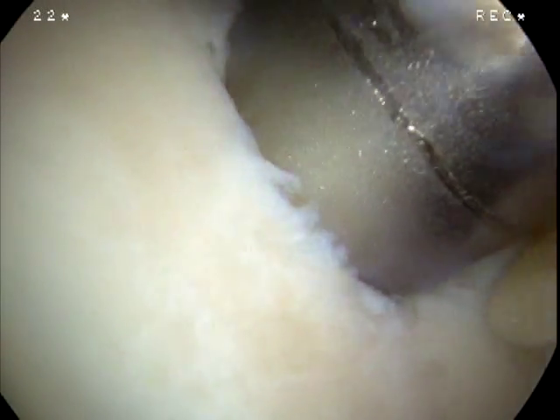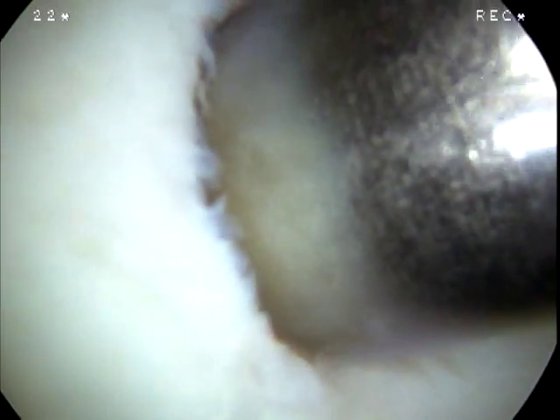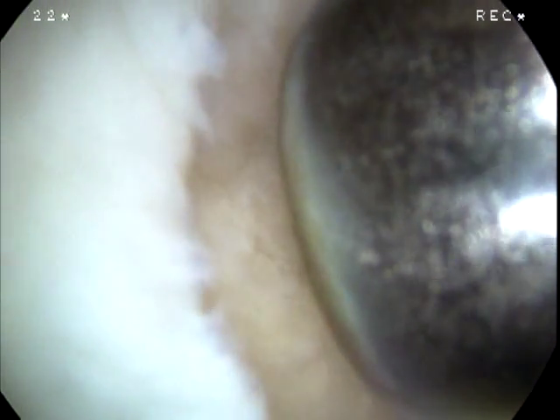Once the base of the lesion is covered with the paste graft the procedure is completed. We have been able to perform paste grafting for small and large defects, including very large OCD defects previously filled with allograft, bone plugs, or other devices that failed. All that is necessary is for the paste graft to remain in the small holes created by the morselization technique and for those cells to see the joint fluid and joint environment. When motion is applied by a CPM machine, those cells are stimulated to form cartilage rather than bone.